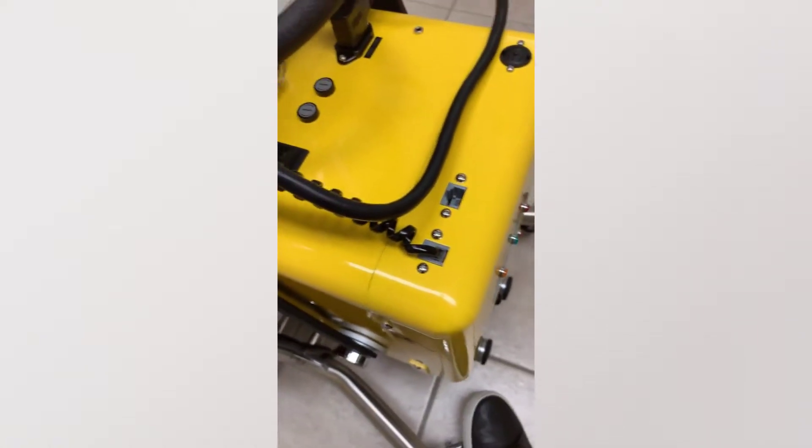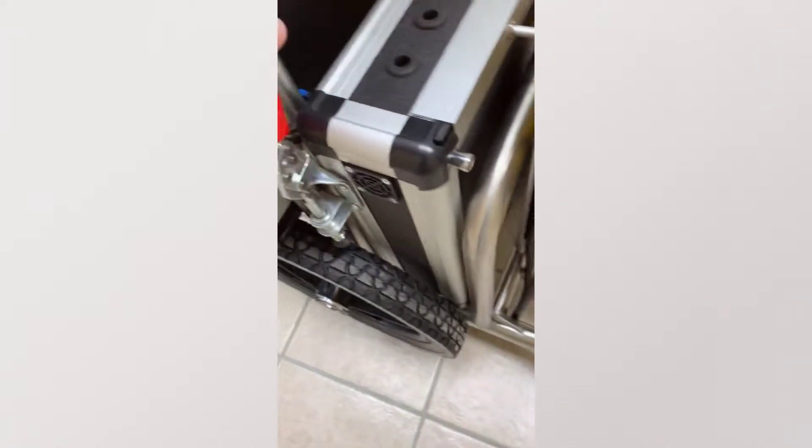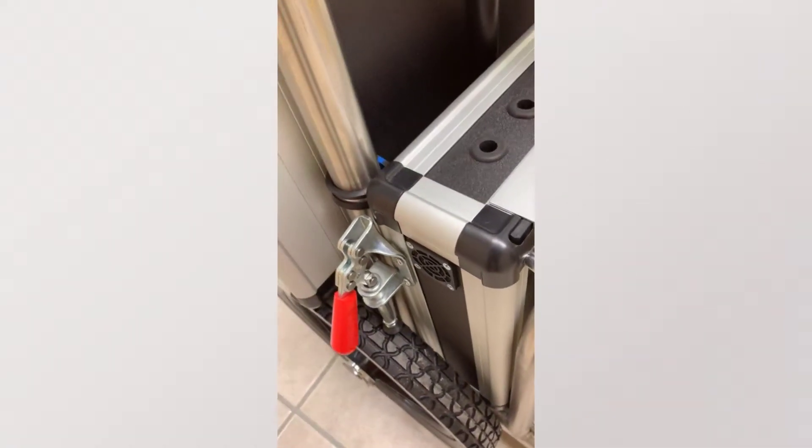If you want to lock the front wheels, there is a press button here. You click on that and press it down and it will lock it. If you want to lock the back wheels, the lever here will lock.